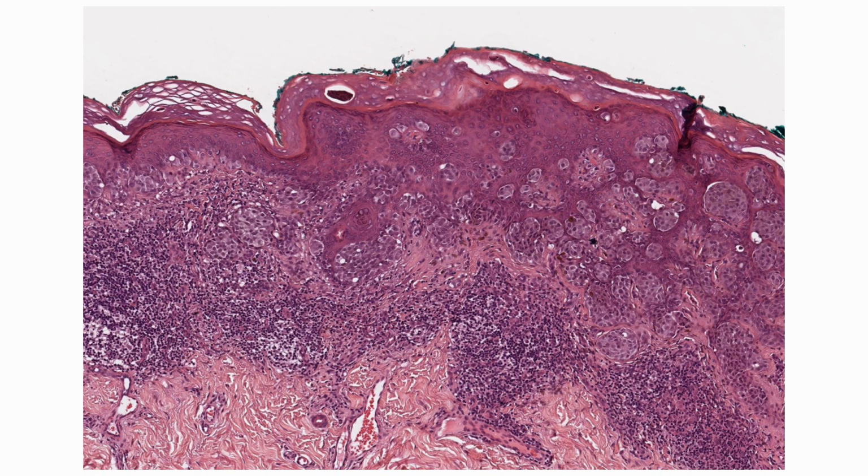So this is the general histology of melanoma, and you can see the melanocytes. They have a proliferation along the dermal-epidermal junction with many random nests of melanocytes here and there with pagetoid extension, upward migration into the epidermis. Also, there are nests of atypical melanocytes in the dermis as well.